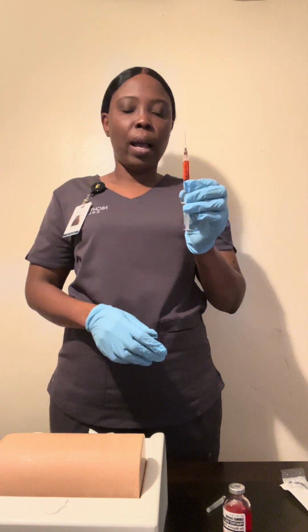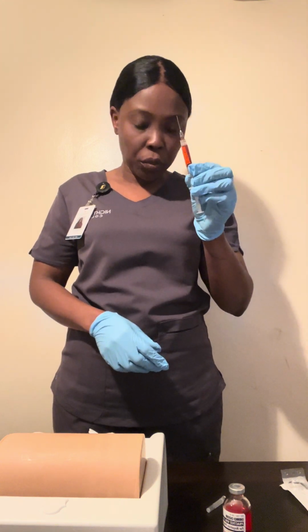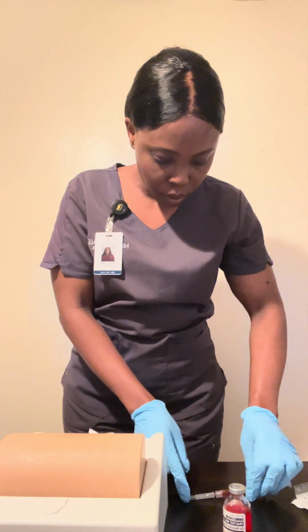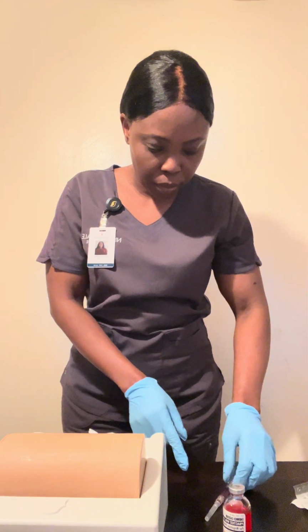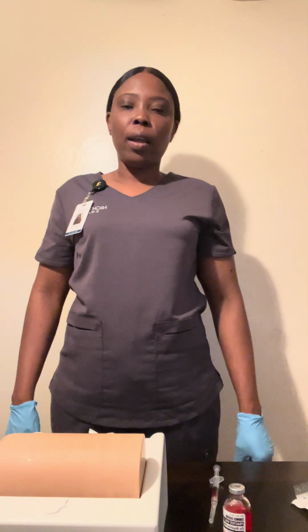Okay, I'm gonna tap for air bubbles. I'm gonna uncap the safety. I'm gonna cap the needle back, and then withdraw it away from the patient. I'm gonna label the medication and the dose.